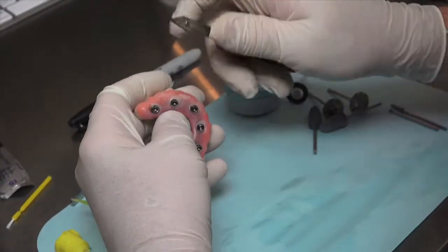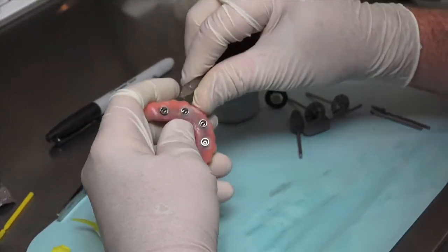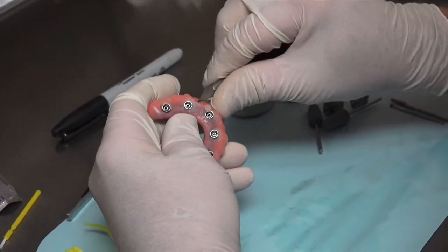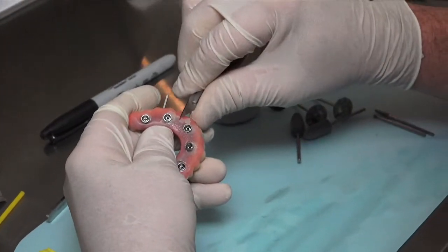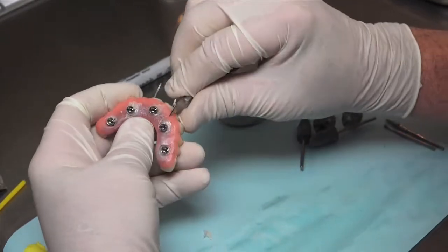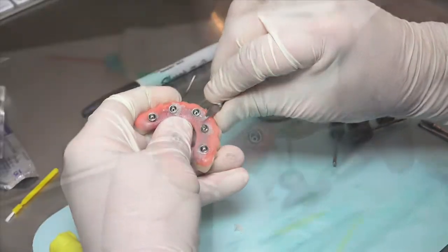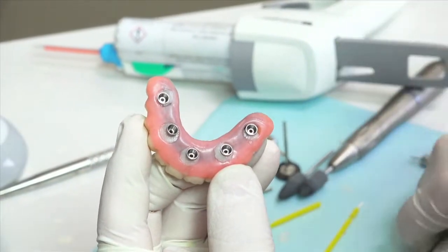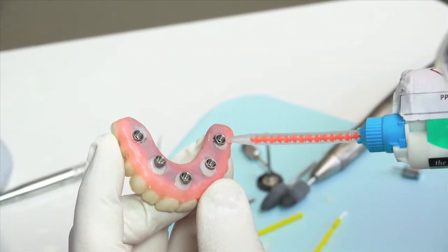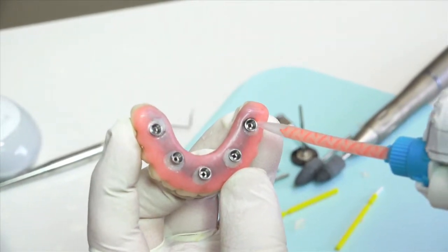To finalize the long-term provisional for delivery, remove any flash from the tissue side of the provisional. Because a light coat of Vaseline was previously applied to the provisional, it can be easily and quickly removed. Ideally, you don't want any acrylic on the actual collar of temporary copings. Once the excess flash has been removed, look for any voids and or any areas that may need additional material. The objective is to have a smooth and hygienic transition from the provisional up to the metal margin of the temporary cylinders.